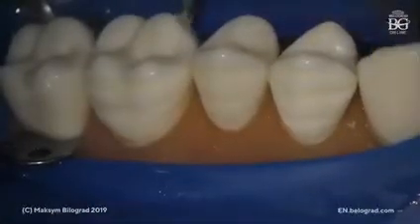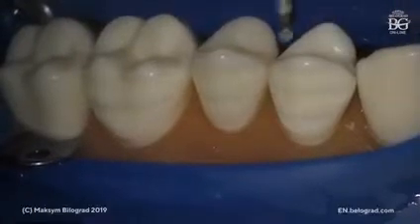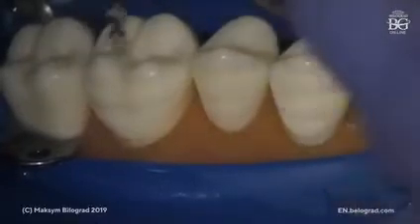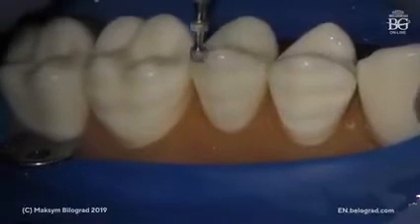This premolar will be prepped for partial occlusal reduction. This one will be with a full occlusal coverage. So this molar window prep, we will not do anything from occlusal surface. We will just keep these preparations from buccal surface. This premolar, we will do some partial preparation.